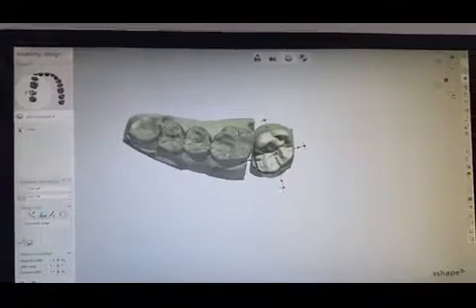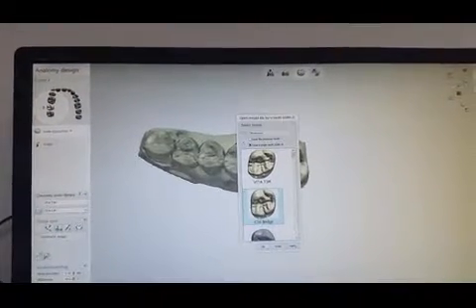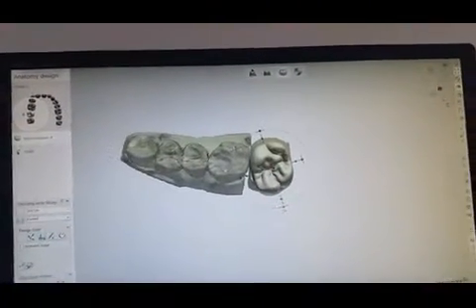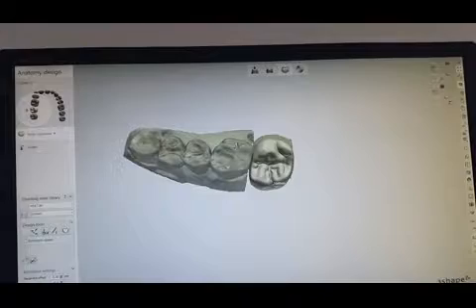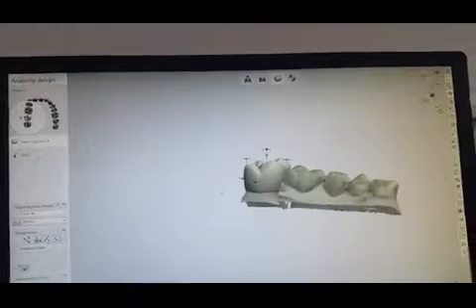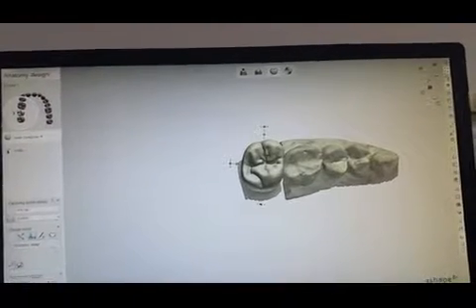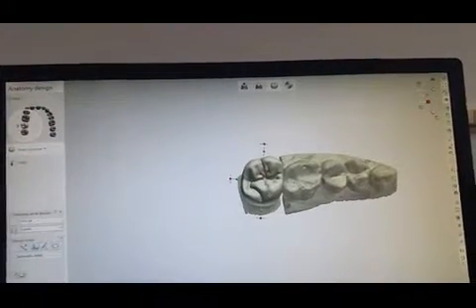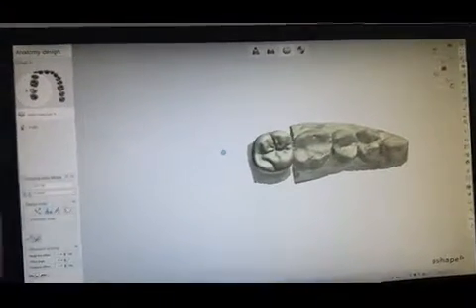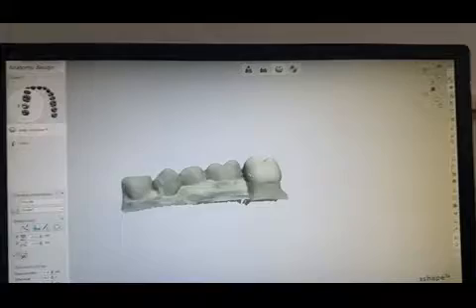Now I'm going to take this and change the library. I'm going to go with this library, and then I could either try to put this in the proper position manually, which on big cases is the only way to do it after the initial proposal. But on single units there is an option here where I can tell the computer to position the crown, and I can modify it of course later. It's just a little quicker.